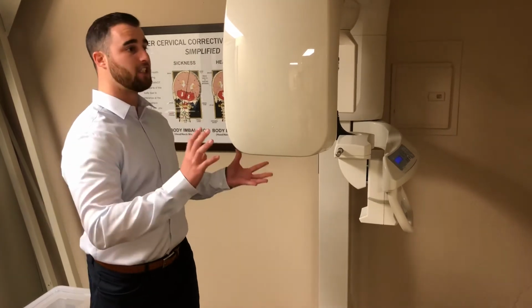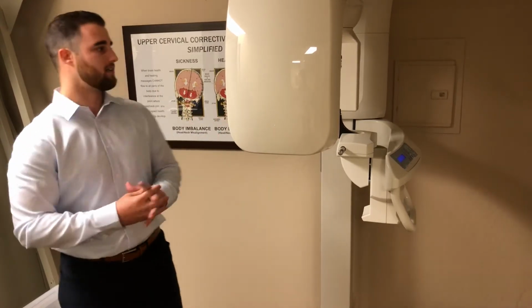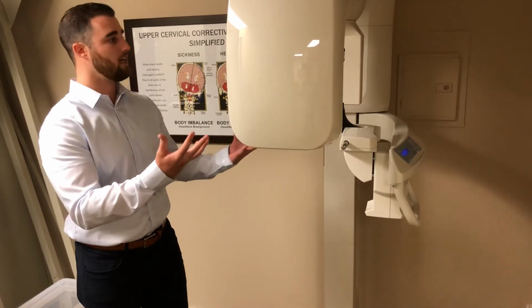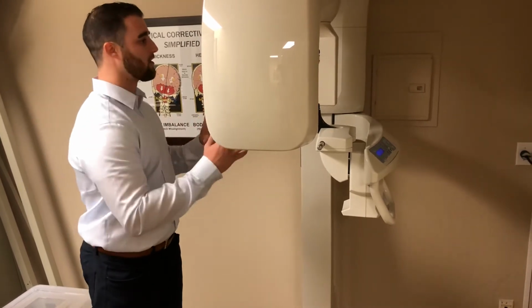So I just wanted to illustrate a little bit of what the new imaging shows us and how that could impact you. This is the new imaging here. It's a cone beam CT. You may have seen this in your orthodontist or dentist office before. Essentially, the patient approaches the machine. It's about a 25-second scan. It's a tenth of the radiation of standard x-ray that's been previously used. It's quicker, it's safer, it's faster, and the quality of imaging is like we've never seen before.